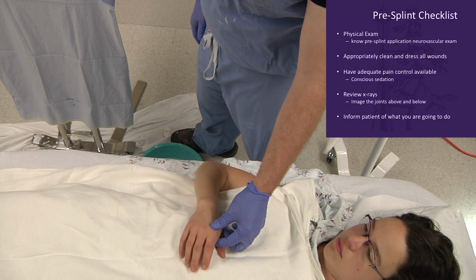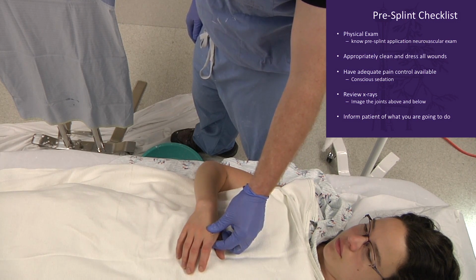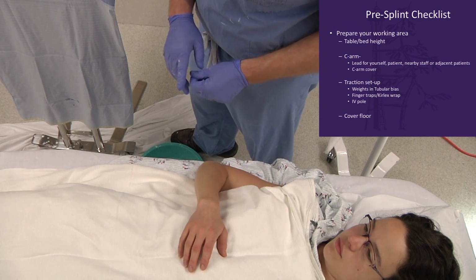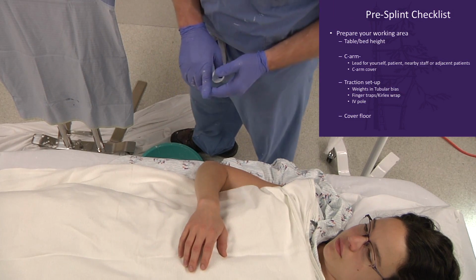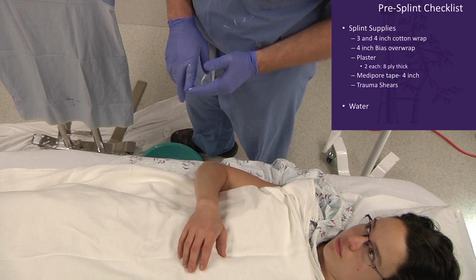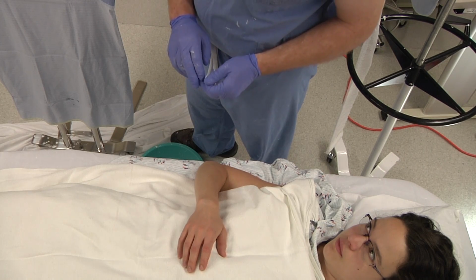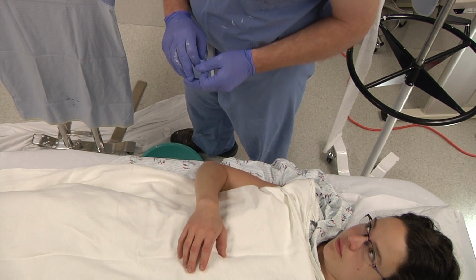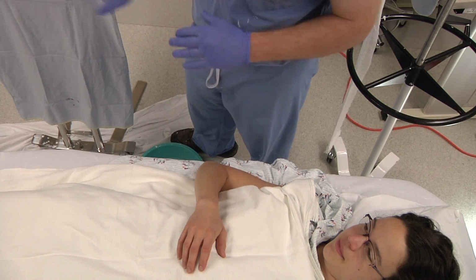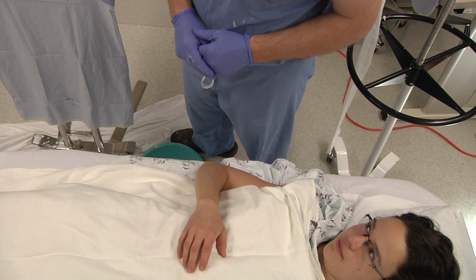We'll be going through how we commonly put on a short arm splint at Harborview Medical Center. The first thing that we generally do after, of course, completing a thorough neurovascular exam of the patient prior to any splinting, reviewing any radiographs that have been taken, as well as acquiring proper analgesia for the patient, and having our supplies ready. After that point, we talk to the patient to make sure they know what we're going to do, and then we're ready to splint.